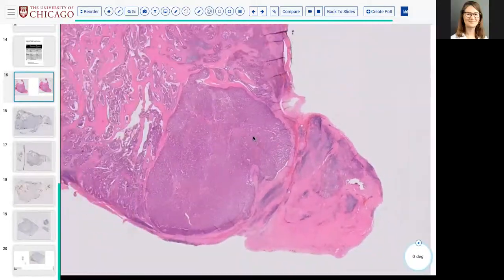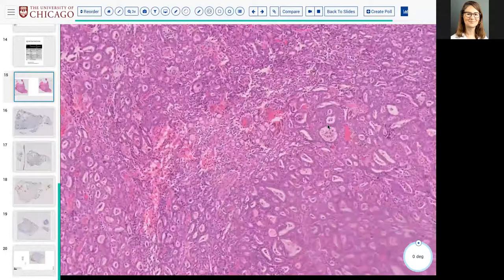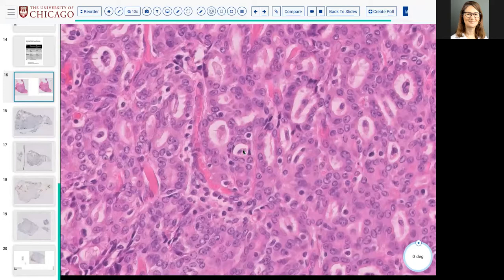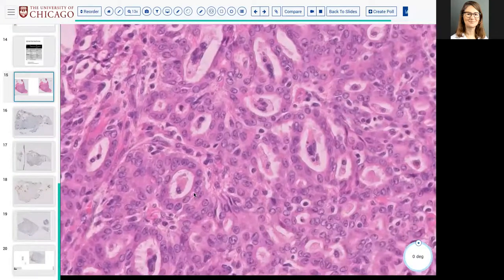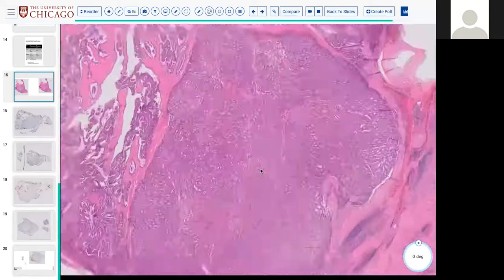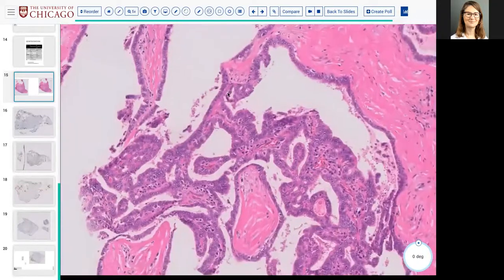So you guys are really on the mark with, is this a variant of PTC, is this something else? The one thing that bothered me was that for a PTC, these nuclei are all nearly perfectly oval. They all have moderately stippled chromatin and small nucleoli. Where are my significant grooves? Where are my wrinkles, my cup shapes, my pseudoinclusions? These nuclei are just weird, not convincing for PTC.